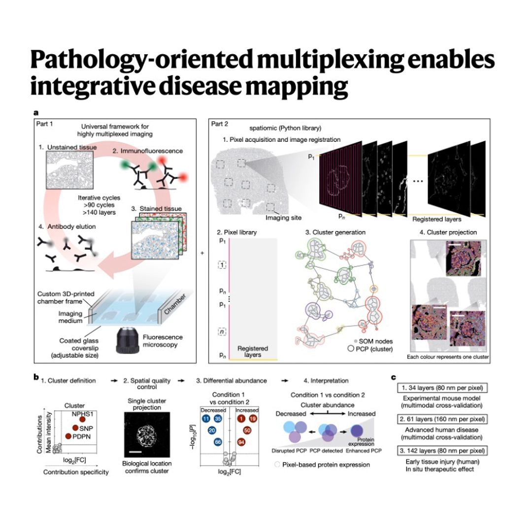Sounds intense. What's in it? It's a mix of things like glycine, urea, guanidine hydrochloride, and TCEP. The whole thing is adjusted to a very acidic pH, around 2.5. Whoa, okay. That sounds like it could dissolve anything. How does it clean without destroying the tissue? It's carefully optimized. Think of it like a very effective but gentle molecular scrub brush. It's designed to strip off the antibodies from the previous cycle completely, but without messing up the underlying tissue structure.